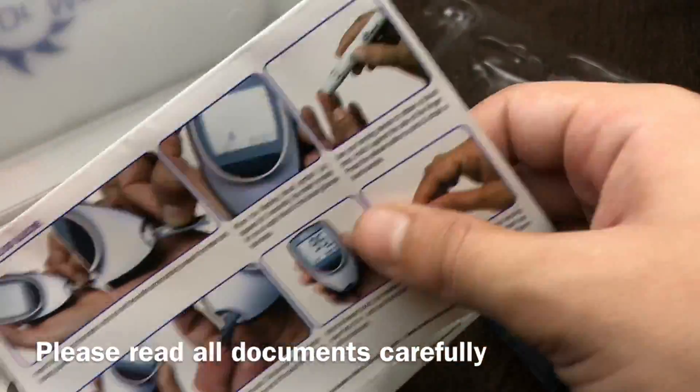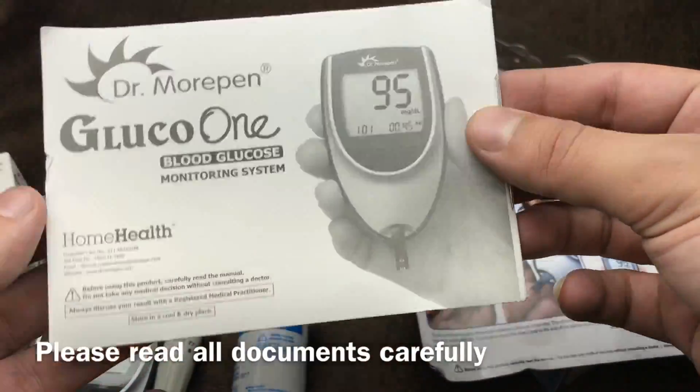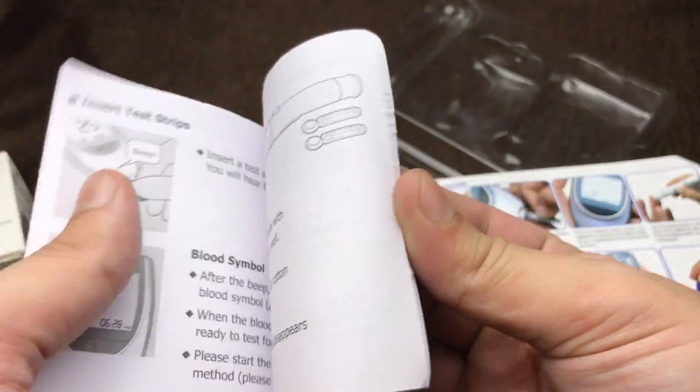Here are some documents. My suggestion is to read all the documents carefully before using it, and read the do's and don'ts as well.